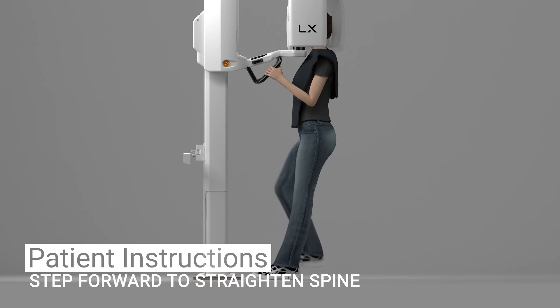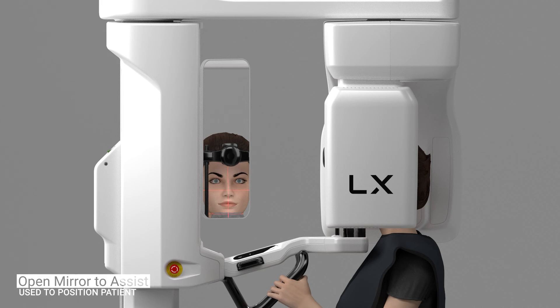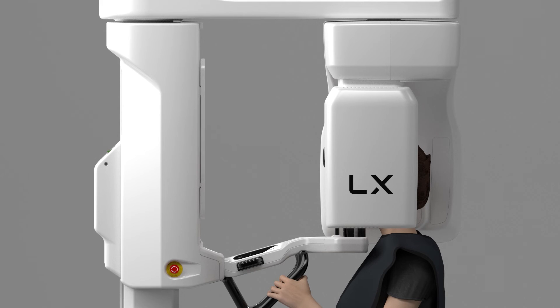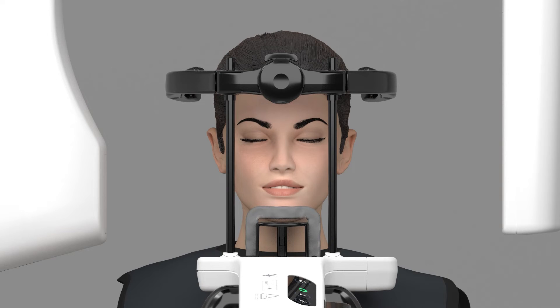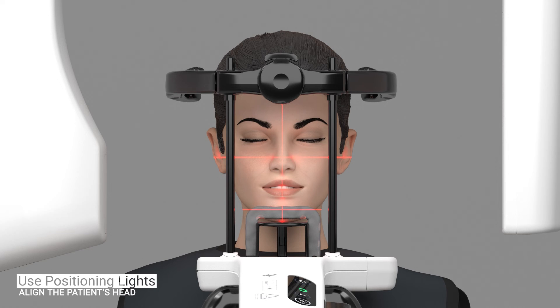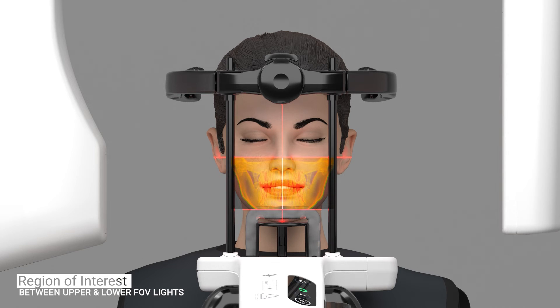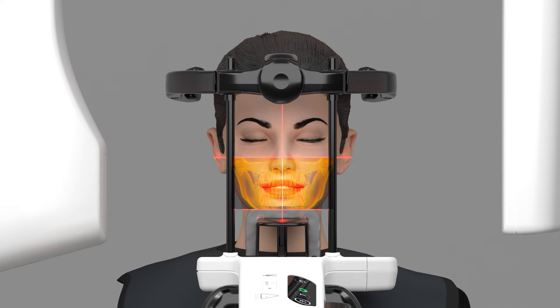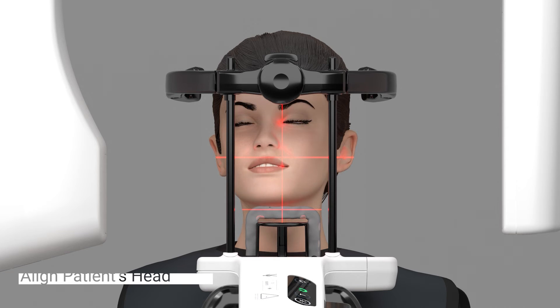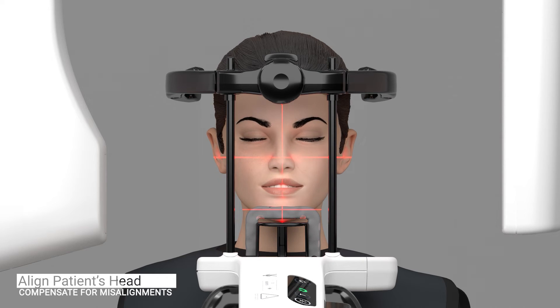Ask the patient to take a step forward to straighten their spine. You can open the mirror and use it to assist in positioning the patient — close the mirror before acquiring an image. Turn the patient positioning lights back on by pressing the positioning light button. Use the positioning lights to correctly align the patient's head; the region of interest captured is located between the upper and lower horizontal field of view lights. Ensure the patient's head is aligned with the mid-sagittal positioning light — the head should not be turned or tilted. Compensate for misalignments by manually moving the patient's head or by adjusting the unit height.